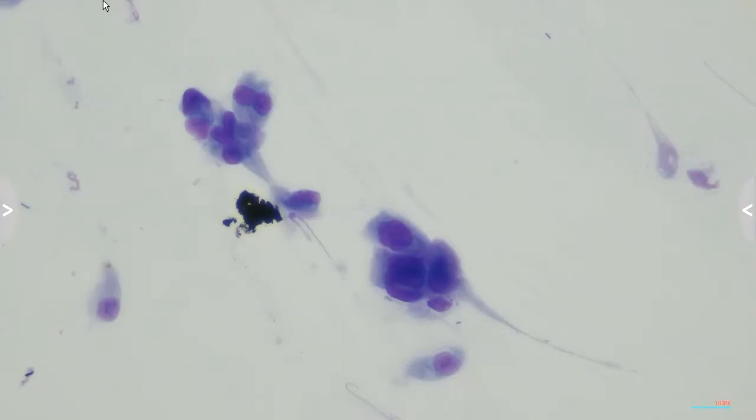So I think this is one advantage of ROSE. Very often if the stricture is long, you don't know where to sample from. But if you've got ROSE and you're able to see under the microscope that you're in the right place, then you don't have to worry about anything. All that you need to do is to get more tissue. So what I'm doing now is not for diagnosis. I'm quite confident from what Conrad has shown me that we have got high quality material in the tissue.